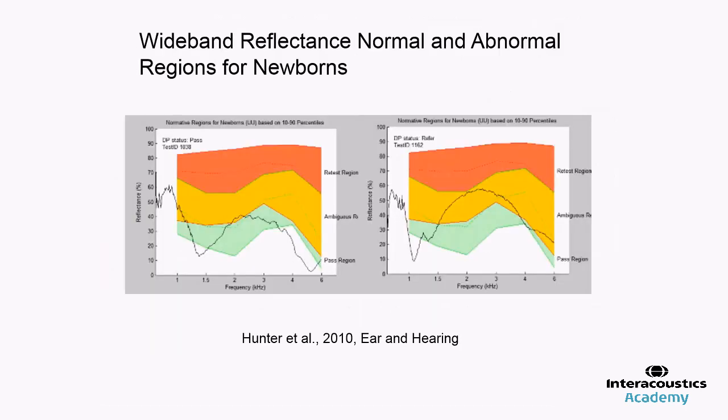This was a study that I did that was very similar to the study that Chris Sanford did. And so it's nice to compare across different studies. Lots of different groups have found very similar effects. So we've got good replicability across many different studies. So this was a totally different sample. And what we have is reflectance rather than wideband absorbance.